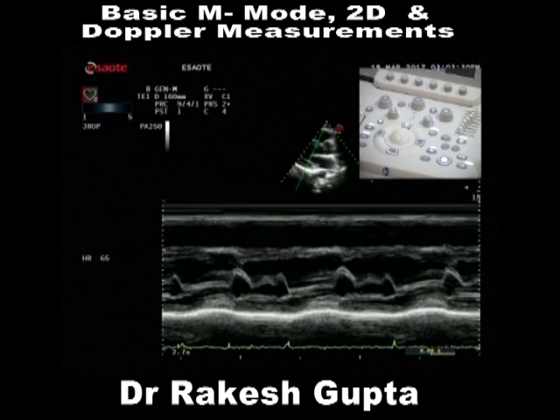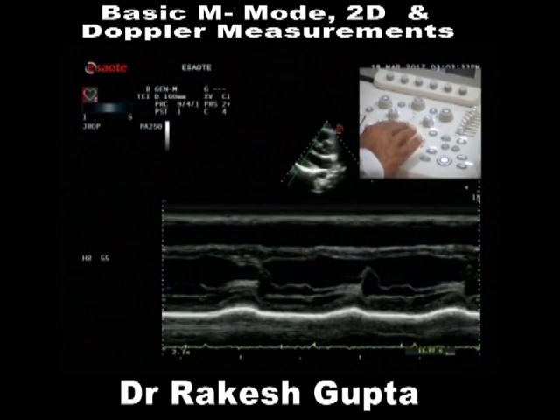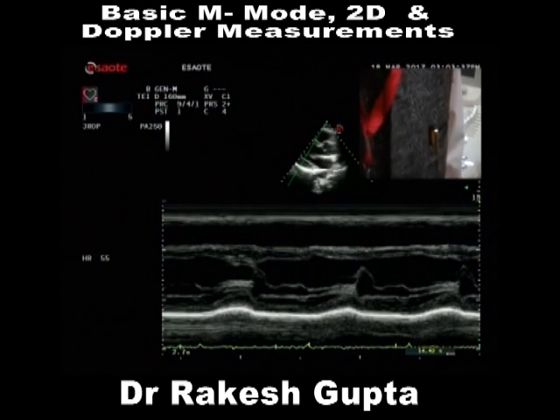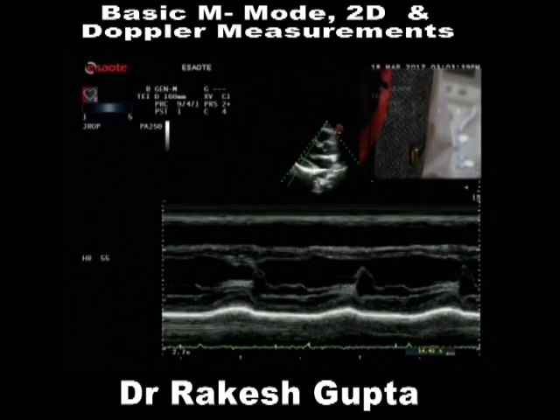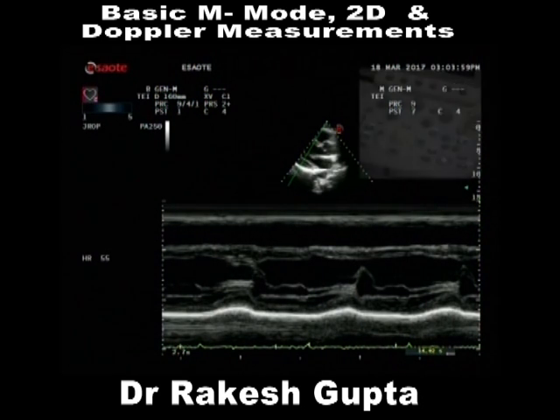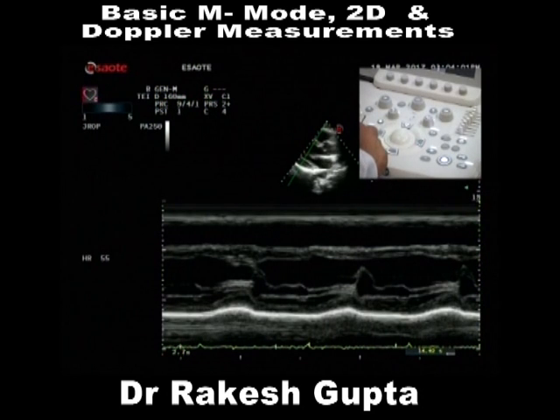I am back. Now I am scrolling it for the LV. When is the LV bigger in size? At end diastole or beginning of systole. So where is end diastole? Here. So you will measure the LV here, this is the diastolic LV, and at the end of systole, this is the systolic LV. Clear? So let's measure this diastolic LV.